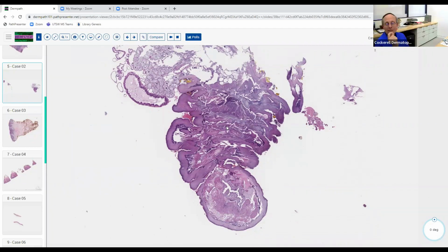Yeah, it's a small, tiny little organism. It'd be probably maybe this big. It's not anywhere near as large as this. And yes, it's sitting in a small burrow in the epidermis. It's the female mite. You'll often see eggs up there, and scybala as well. So that's sitting in the cornified layer. This thing is sitting down in the dermis.